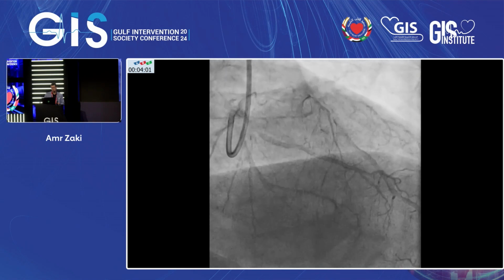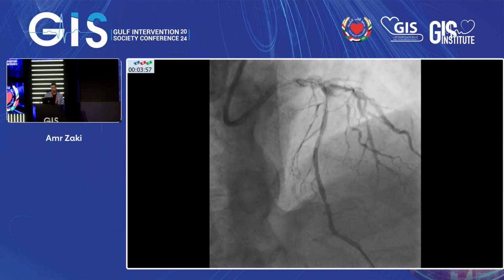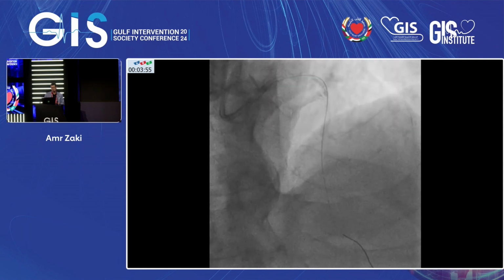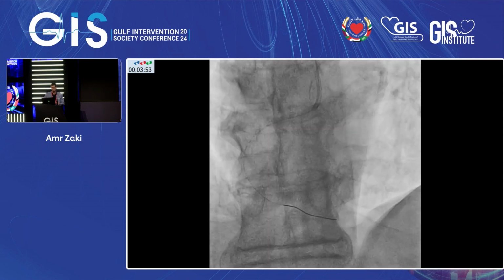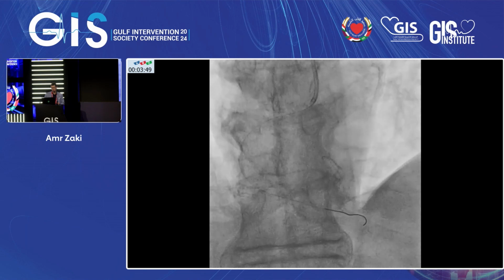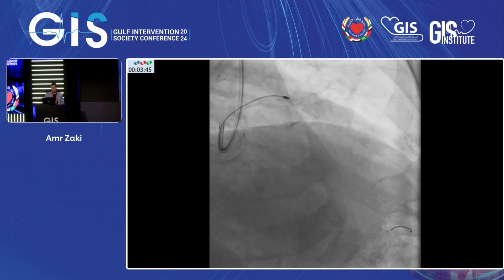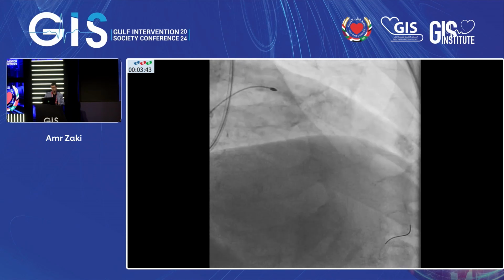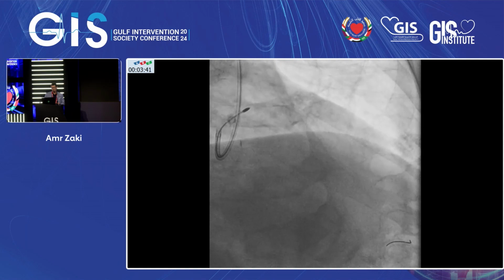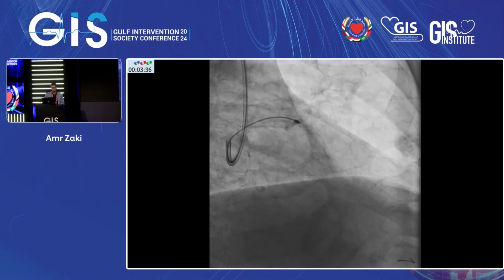There is high calcification of the LAD; the left main is not so involved here. The LAD is heavily calcified, and the right coronary also shows heavy calcium. We had the strategy to go with the rota for the 3 vessels in the same setting. And this is the burr, 1.5, taking it several times, it crossed.